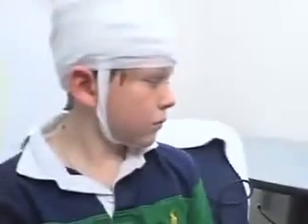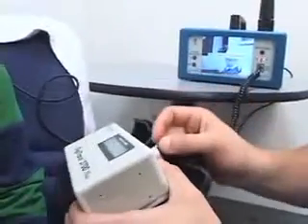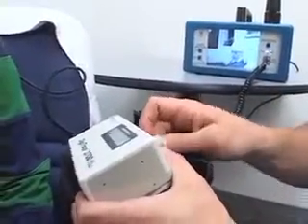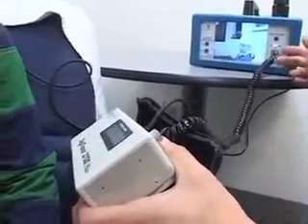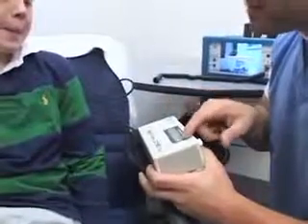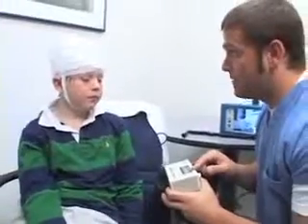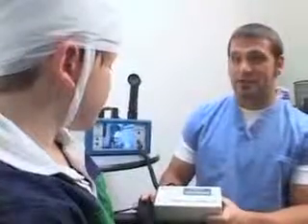In those cases, you will be provided with a video recorder that is easy to set up and use at home. Video images coupled with the electrical signals from the brain can be very valuable to your doctor when certain types of epilepsy syndromes are suspected. Following your setup, our technologist will provide you with instructions for your test and set up an appointment for you to be disconnected. The technologist will review key points to ensure you have a successful study.